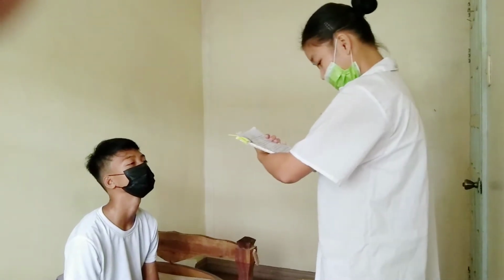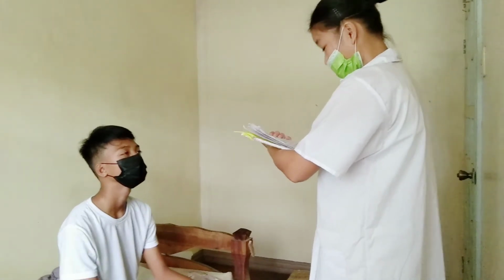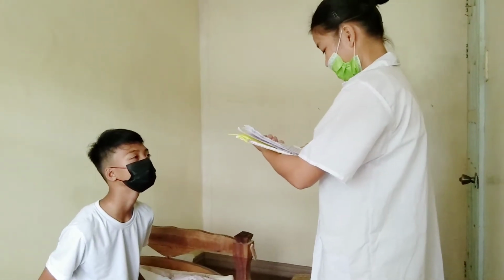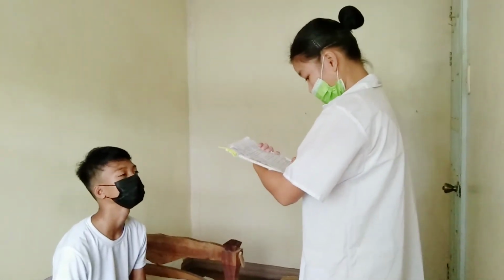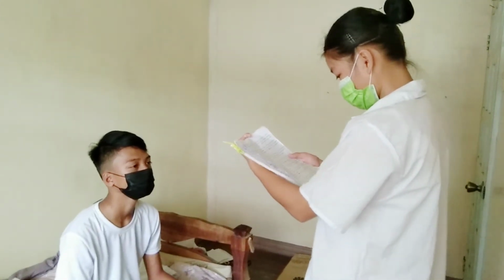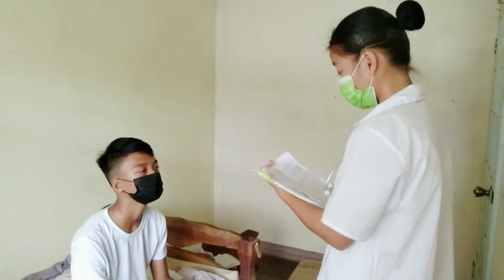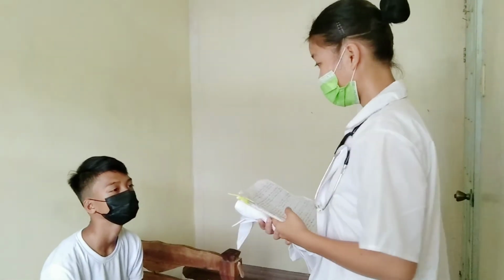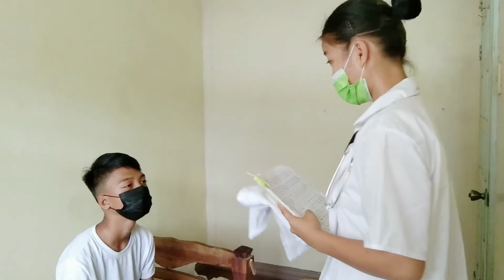First, do you feel chest pain or do you feel uncomfortable? No. Okay. Do you have a past history such as cardiac arrest? No. Okay. Do you have a history of heart disease in your family? None. Okay. Before we proceed, sir, can you please wear this gown?